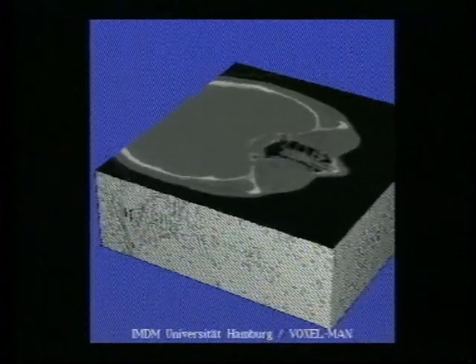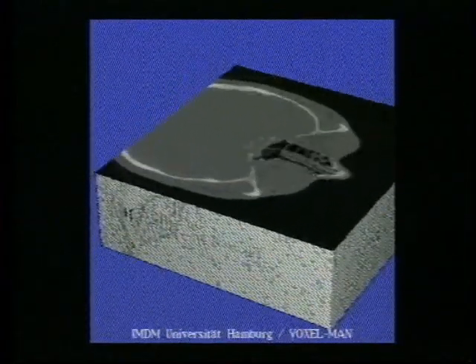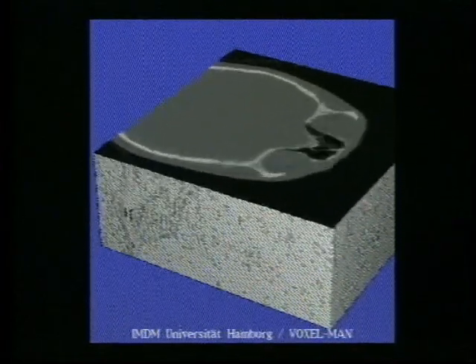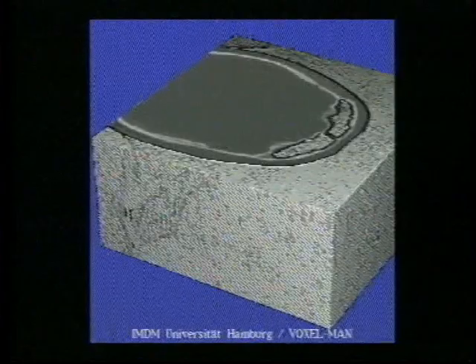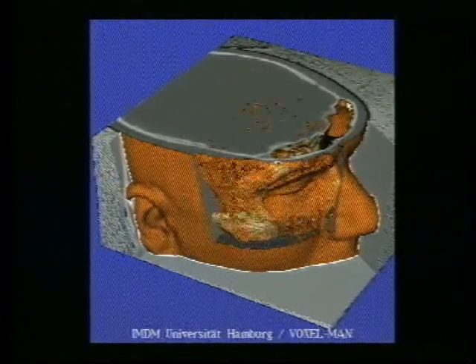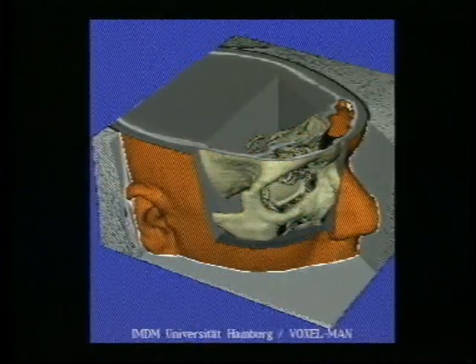However, modern techniques allow direct generation of perspective views from a stack of images. The Institute of Mathematics and Computer Science in Medicine of the University of Hamburg has developed such techniques to extract pictures from a stack of cross-sectional images since 1984.